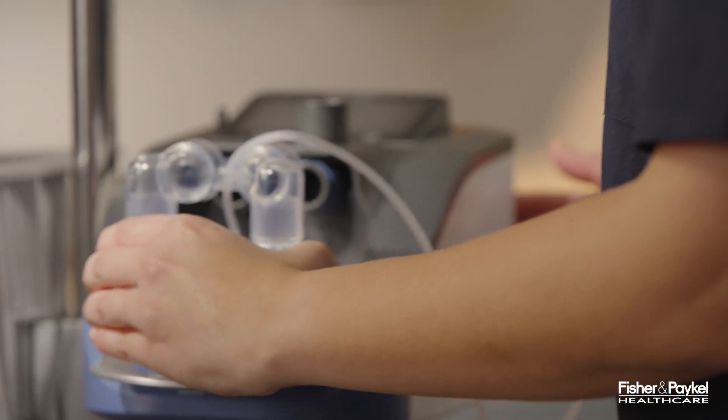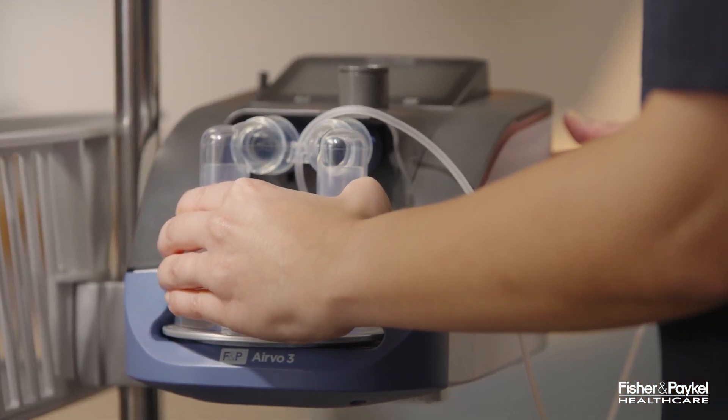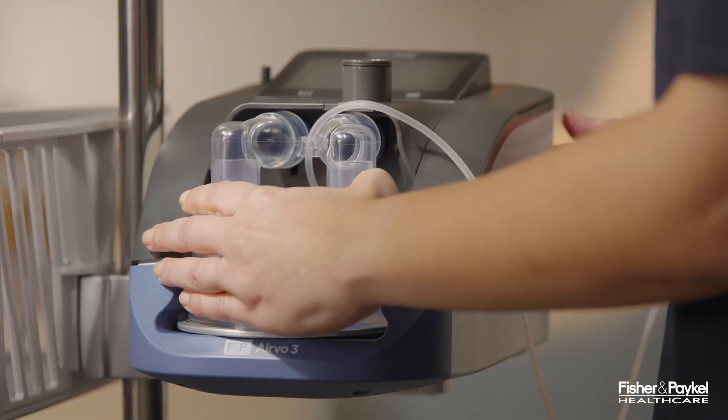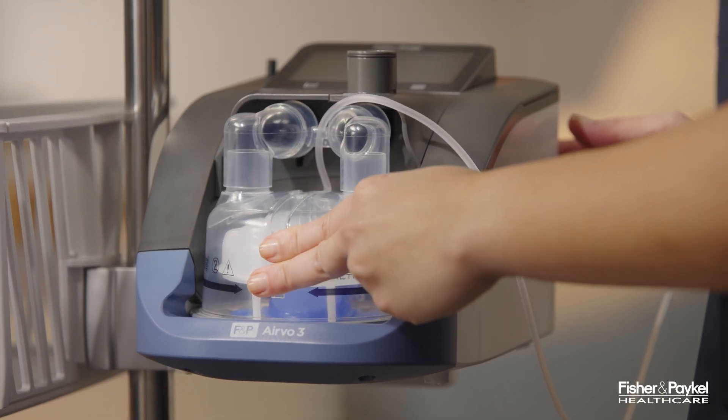Slide the chamber past the finger guard onto the heater plate. Take care to align the port adapter with the ports of the Aervo 3. Ensure the water chamber is fully inserted by pushing firmly on the front of the chamber until it slides past the finger guard.